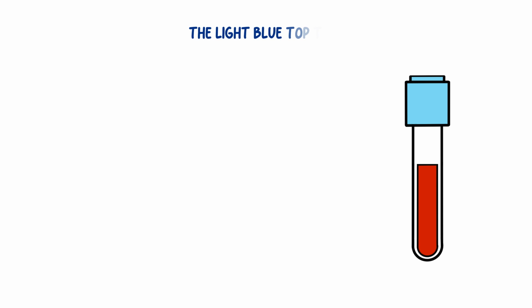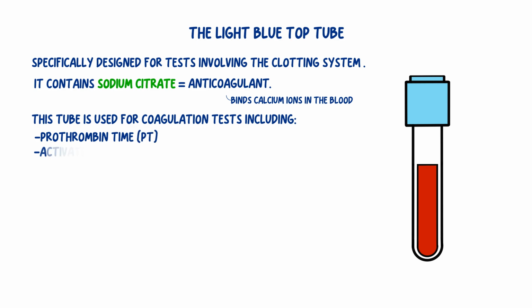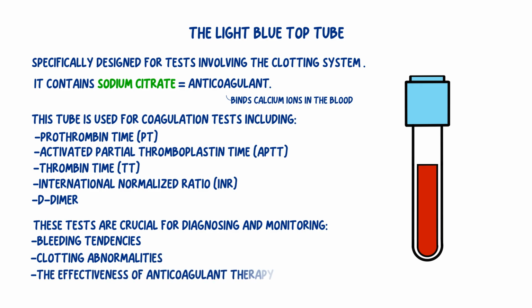Next, we have the light blue top tube, specifically designed for tests involving the clotting system. This tube contains sodium citrate, which is an anticoagulant that works by binding calcium ions in the blood. The light blue top tube is essential for accurate coagulation studies, including prothrombin time, activated partial thromboplastin time, thrombin time, international normalized ratio, and D-dimer tests. These tests are crucial for diagnosing and monitoring conditions related to blood clotting disorders, such as bleeding tendencies, clotting abnormalities, and the effectiveness of anticoagulant therapy.